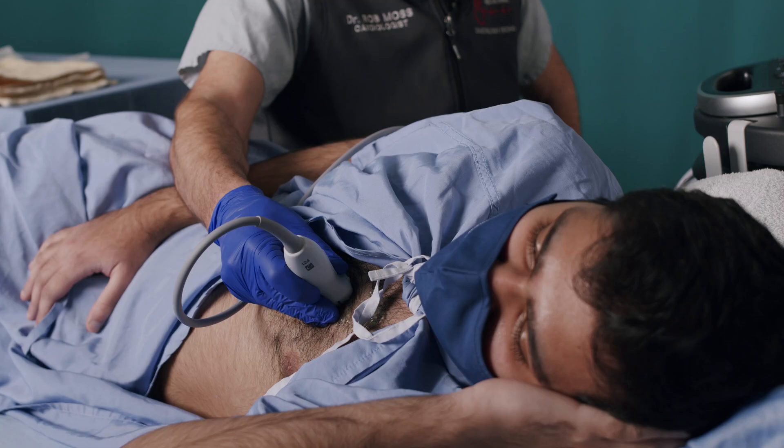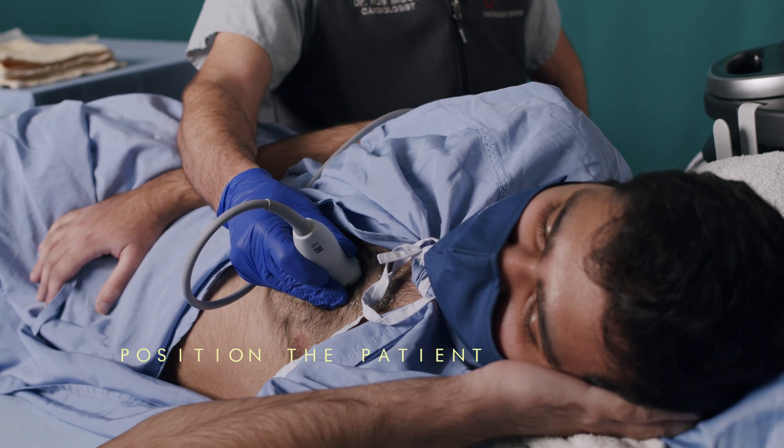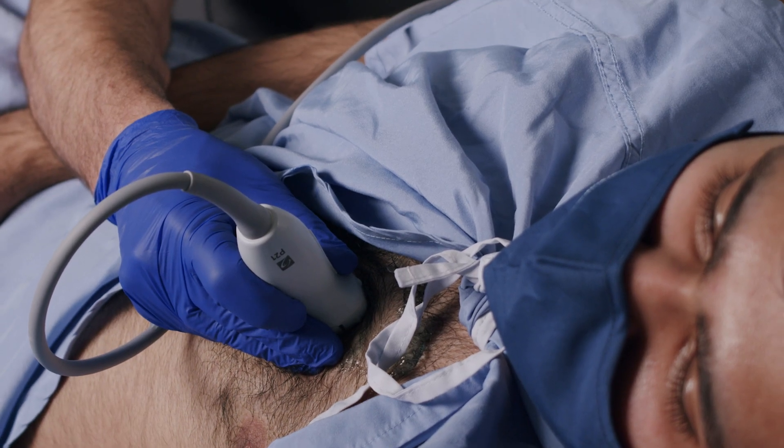Now let's position our patient. For most ultrasound windows, the patient should be in the left lateral position. I like to ask the patient to tuck their left hand under their head. This is particularly important when we come to the apical four chamber view, as it allows the rib spaces to open up.